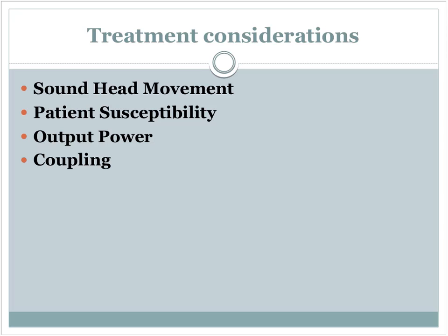The smaller the area, or the more superficial the area, the lower that intensity. If I'm doing something deep, like this person's quadriceps, over the real meaty part of the quadriceps, and they've got a pretty good sized leg, I may need to go up to 2 for that. Typically I'm around a 1 to a 1.5. But you've got to say, are you getting the intended effect that you're trying to achieve? And from there, make an adjustment.